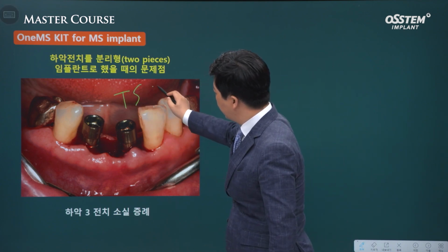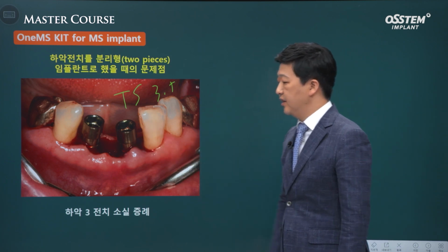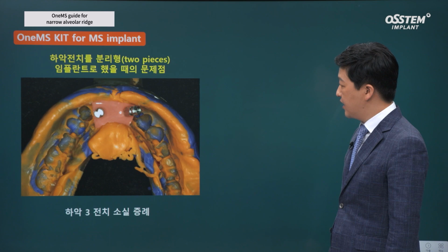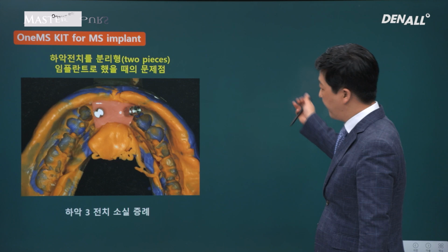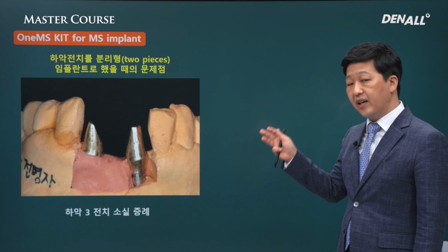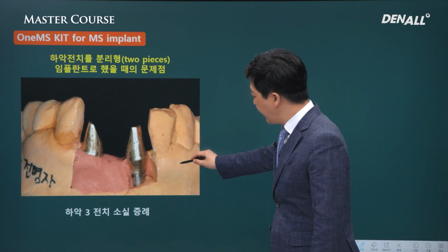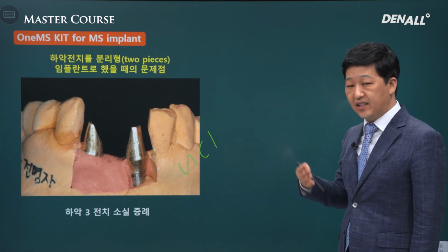TS 3.5 mini implant was placed. This was placed as close to adjacent teeth as possible. Healing is complete and it's time for prosthesis delivery as shown. Analog ways were used to take impression and lab analog was used and model was poured. Appropriate stock abutment did not exist. This is not used these days, but at the time, UCLA abutment using gold, which was frequently used then, was used.